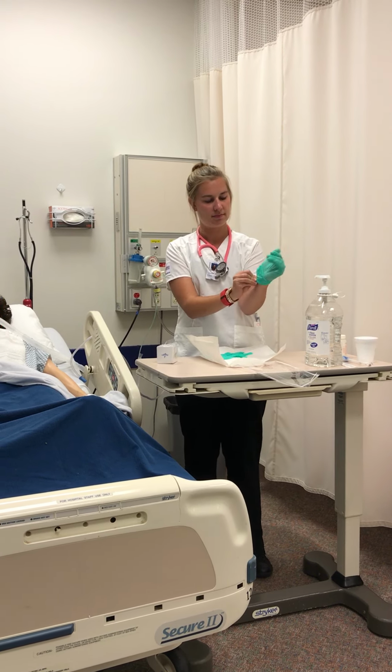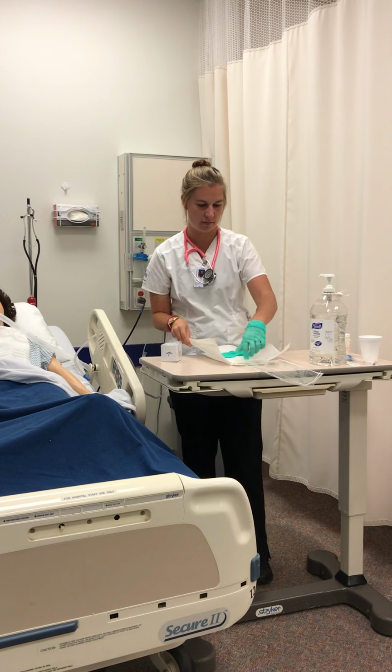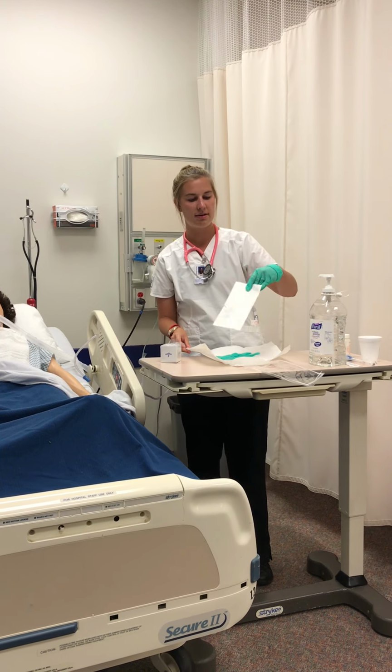Dominant hand, and take my catheter out.